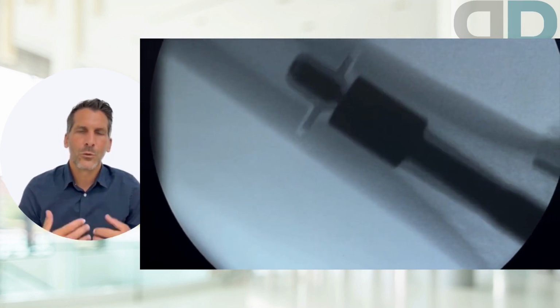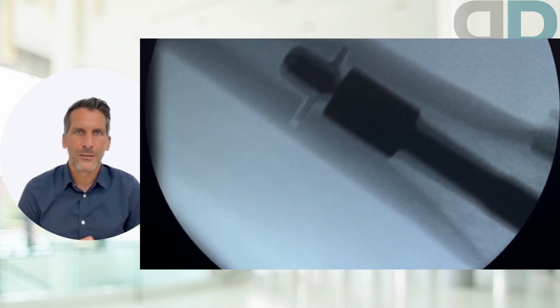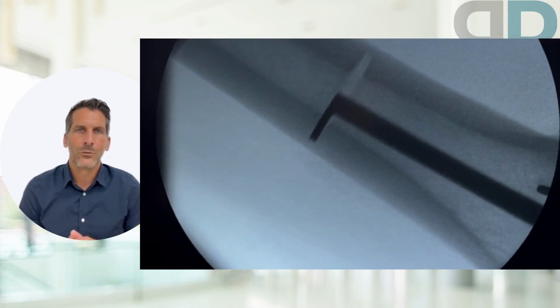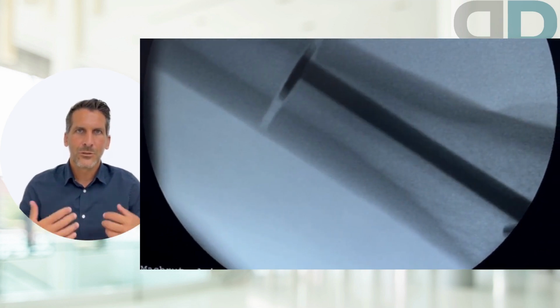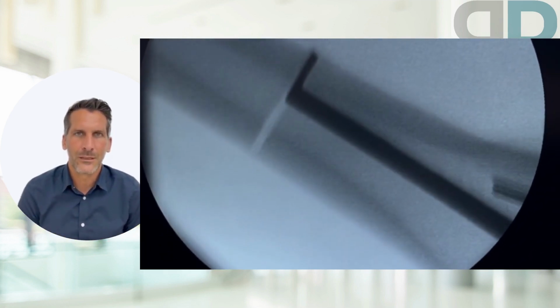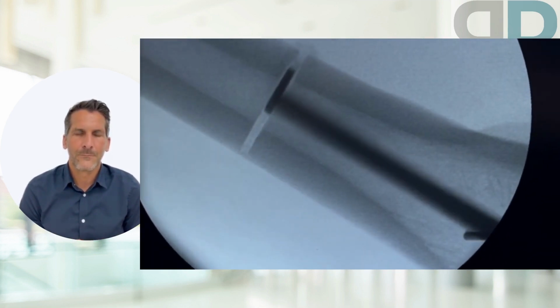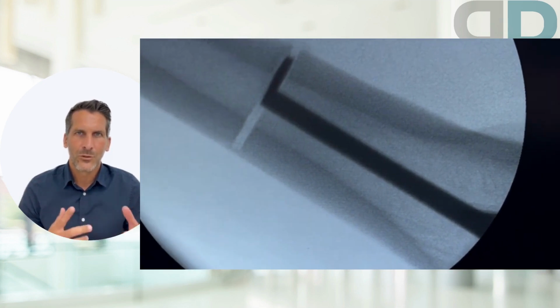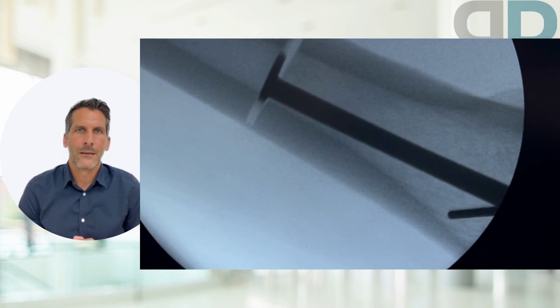In the end, you only need to slowly cut through the remaining bone bridges with a vibrating saw. Subsequently, the bone is completely severed. The surrounding soft tissue is preserved, and additionally, there is the assurance that the adjacent structures are intact. The internal severing requires special tools and demands some skill from the surgeon, but it is a very elegant and safe method for the patient.